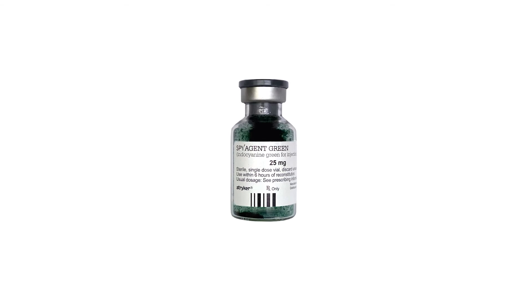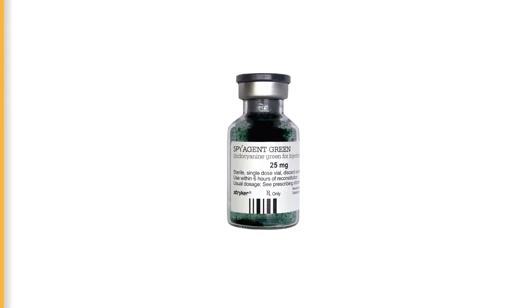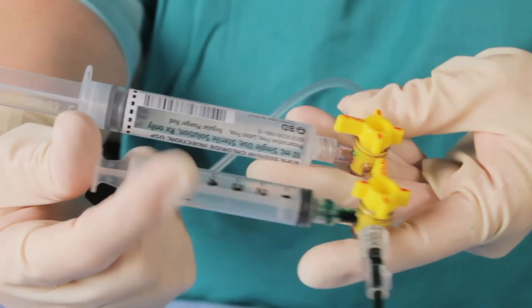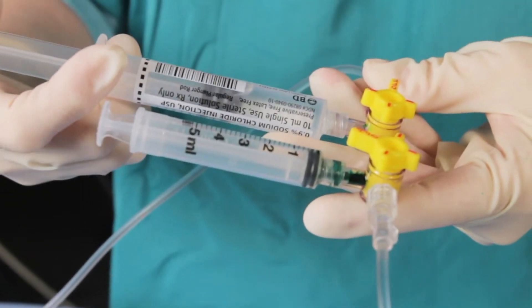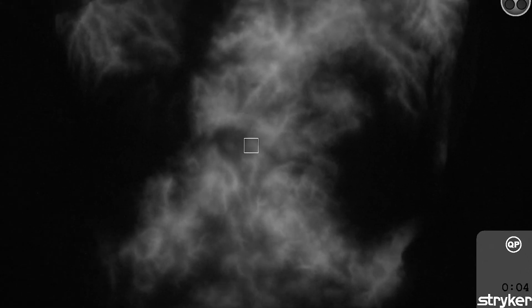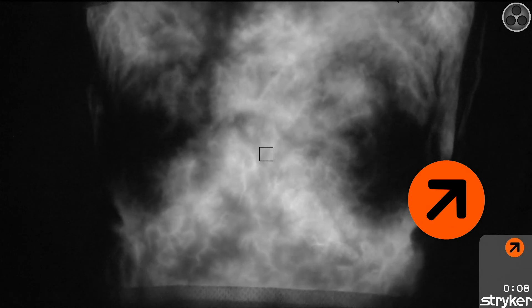On the surgeon's orders, anesthesia administers SpyAgentGreen and flushes with 10 cc's of normal saline. A timer will automatically start in the bottom right corner of the screen when the system detects fluorescence. SpyQP confirms fluorescence and an orange arrow appears.